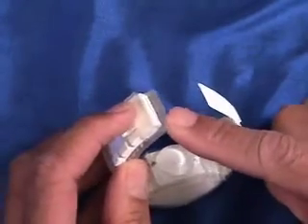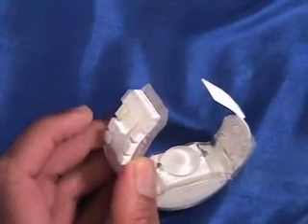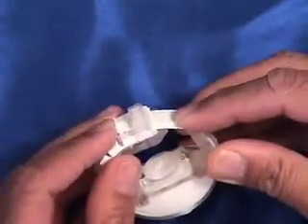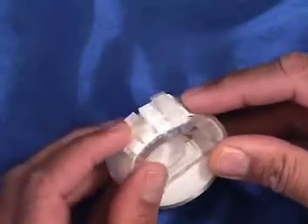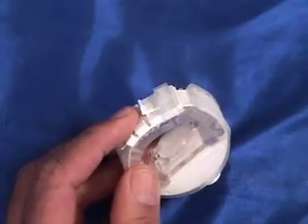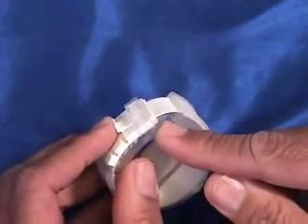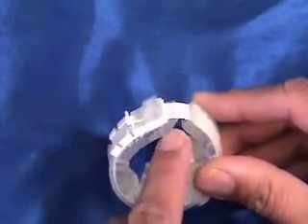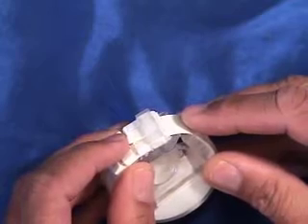Position the protective tongue, the gate and the elevator tab over the penis at the top part. Engage the strap in the gate and tighten the device to a comfortable position. It might be necessary to guide the strap through the rails at this point with the opposite forefinger. At this point, extreme care must be exercised when placing the device to prevent trapping of the skin between the gate and the strap. Proper positioning of the protective tongue and placement of the gauze around the penis will prevent this from happening.